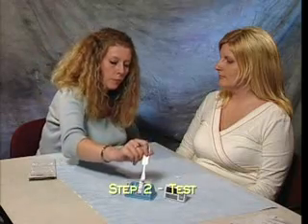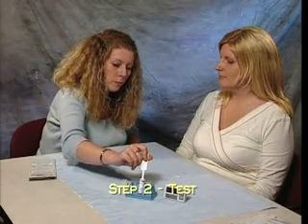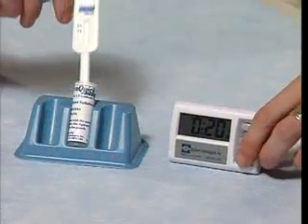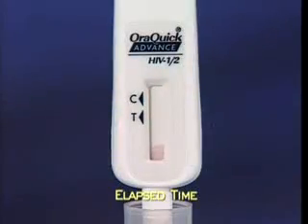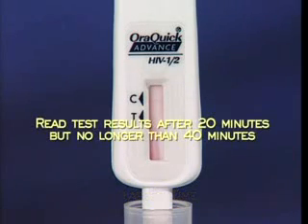Instruct the person being tested to insert the flat pad of the device into the vial, making sure the device reaches all the way to the bottom of the vial. The device must remain in the vial for the duration of the test. Pink fluid will appear and travel up the result window, and will eventually disappear. Results may be read after 20 minutes, but not after more than 40 minutes.